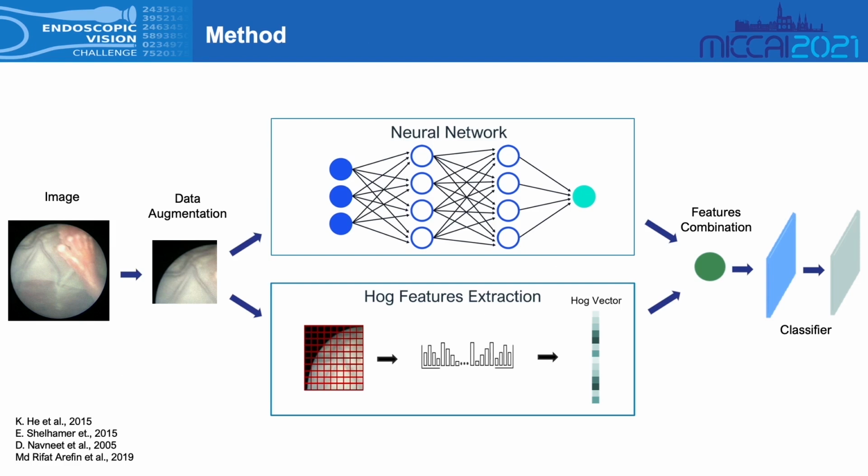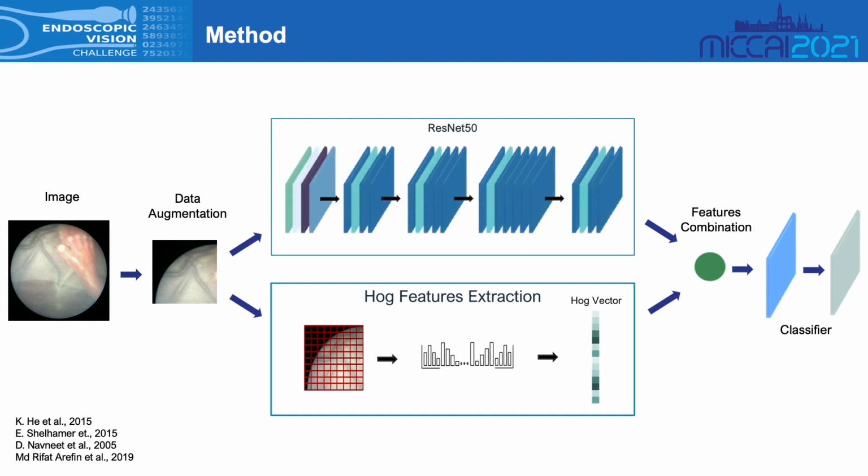Histogram of oriented gradients is a method to characterize object shape and appearance by the distribution of local intensity gradients or edge directions. This method can be applied to different architectures. After implementing different models, the best performances were reached with ResNet 50 as backbone, which is based on deep residual learning. The fully connected layers in the classifier are replaced by convolutional layers in order to output a heat map. The proposed histogram of oriented gradients vector injection is applied in the study at latent space level, but it could be embedded at different layers of the network.